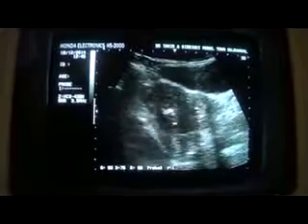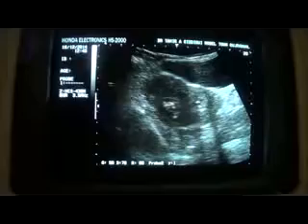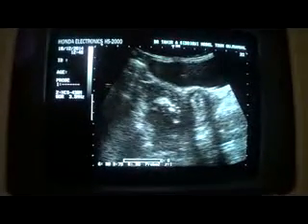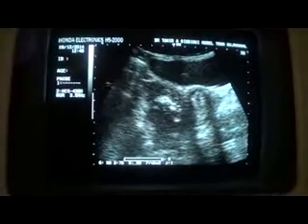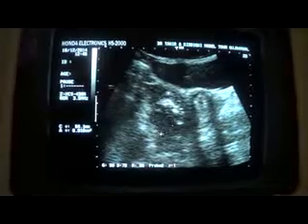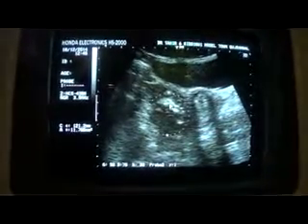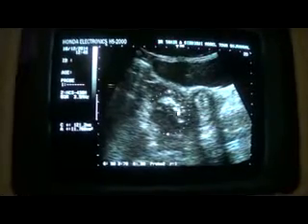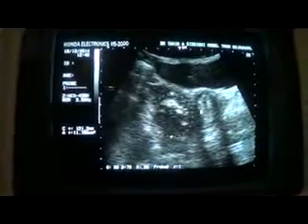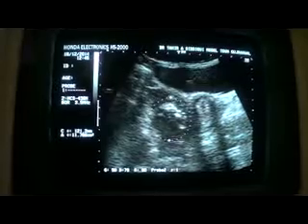And as I move the probe posteriorly, I see this is the endometrial canal. I have to move the probe posteriorly to get the solid echogenic area. So this area, I'm repeating it, is the solid echogenic area, which is a fibroid with internal tiny calcifications, anterior half, and this is the cervix of this patient in transverse section.